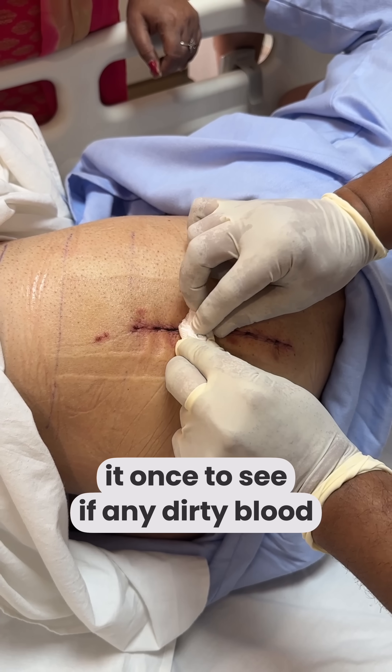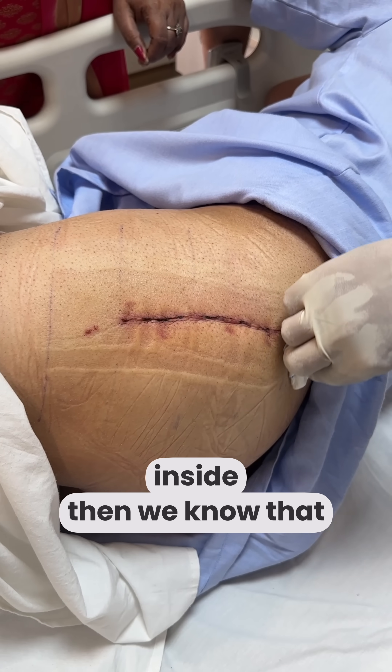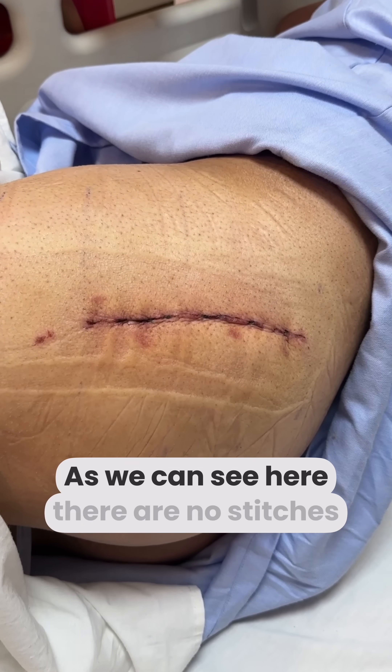We will check that no discharge is coming out. After that, we confirm that we don't need to do anything else. There are no stitches that need attention.